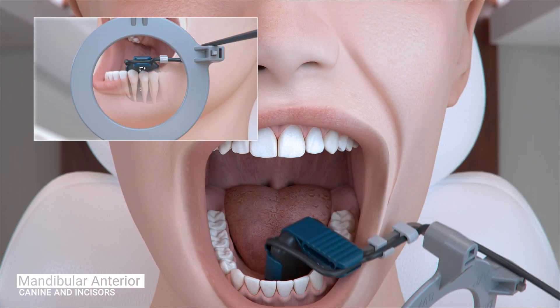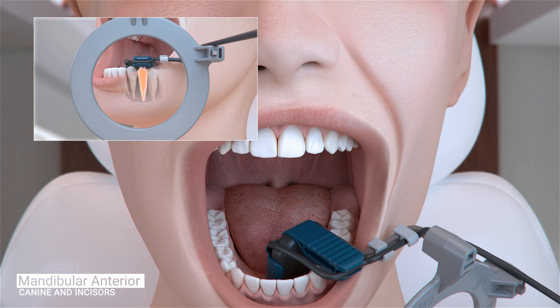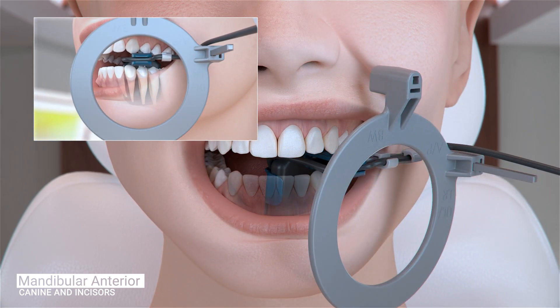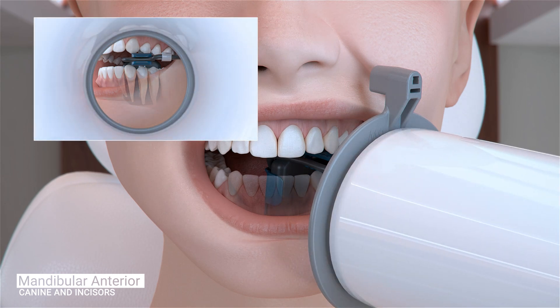Position the sensor so the canine is centered on the sensor and the sensor is parallel to the long axis of the tooth as much as possible. The tongue should be mildly displaced so the sensor can be inserted into the floor of the mouth and far enough away from the teeth as not to impinge on the mandibular curve. Ask the patient to gently close and slide the aiming ring as close to the patient's chin as possible. The cone of the x-ray emitter must be placed flush with the aiming ring and then trigger the exposure.